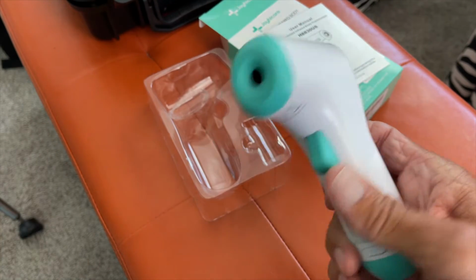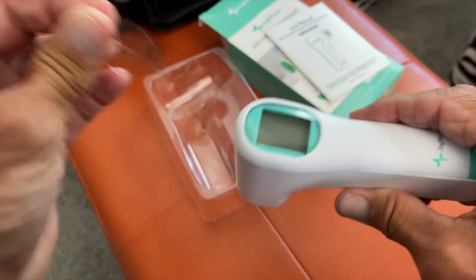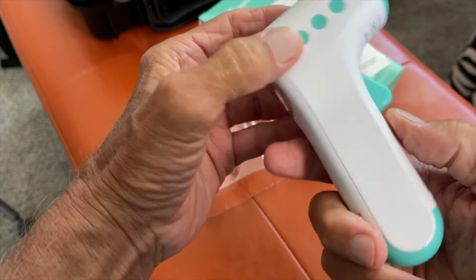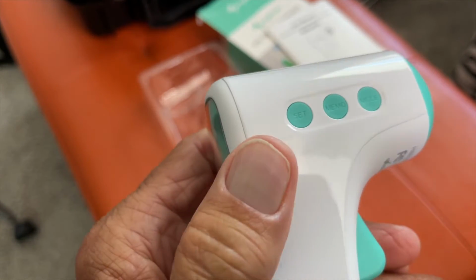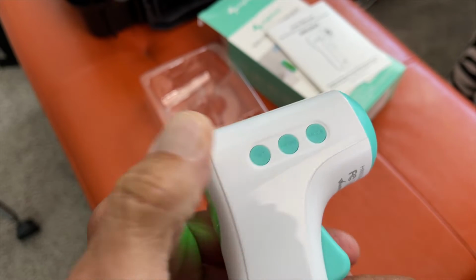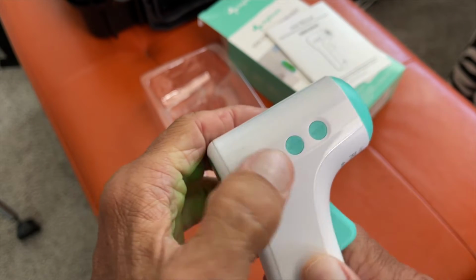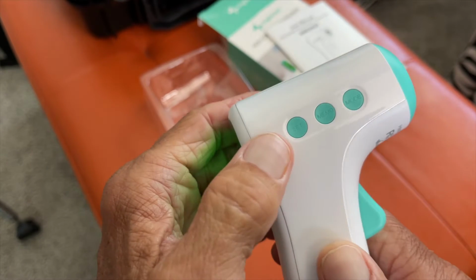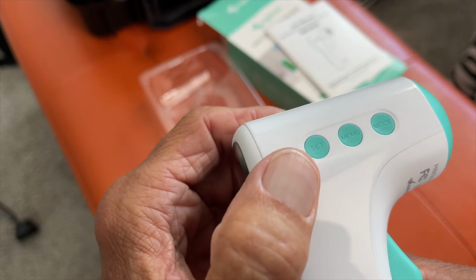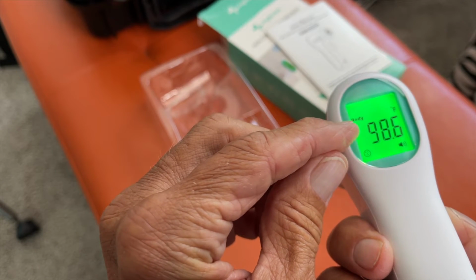Now what we've got to do is try it on our head. And, oh, let's pull this off. I think is there an on button on it? Oh, right here, what is this? Set mode. So it's got 98.6 body. I don't know what that is. That says memo, and this is mode. So I guess it's body.